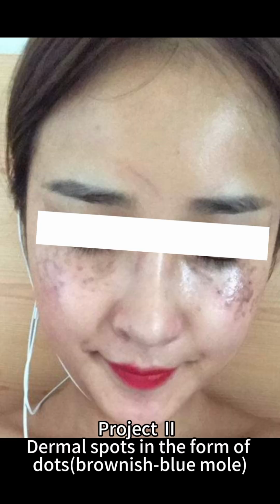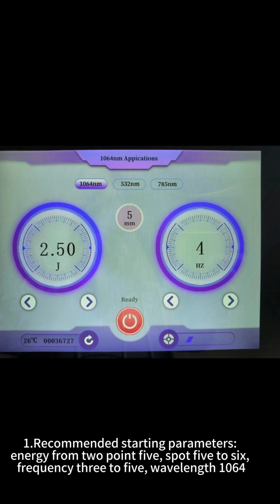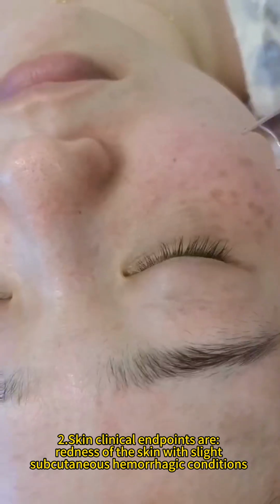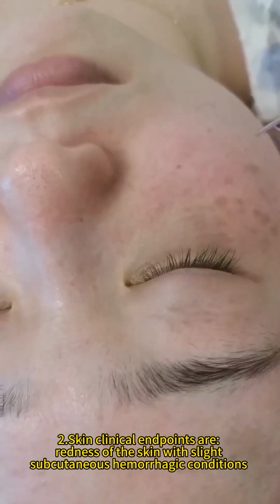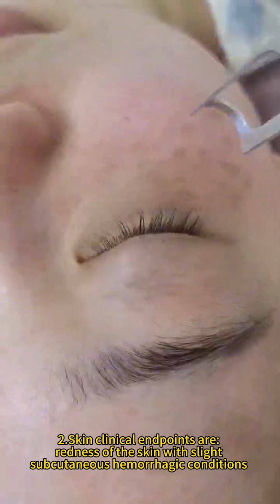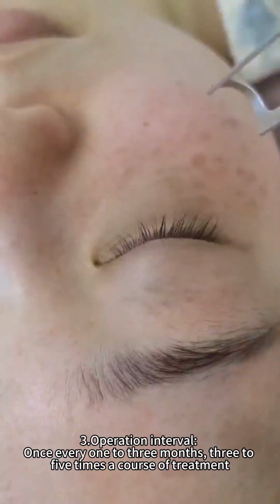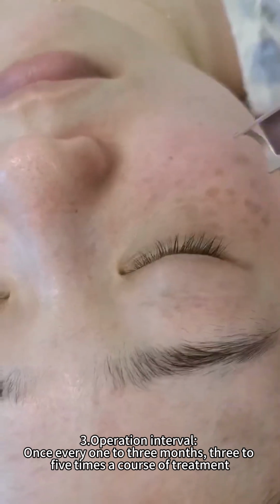Project 2, dermal spots in the form of dots, brownish blue moles. Recommended starting parameters: energy from 2.5, spot 5 to 6, frequency 3 to 5, wavelength 1064. Clinical endpoints of the skin are redness of the skin with slight subcutaneous hemorrhagic conditions. Operation interval, once every 1 to 3 months, 3 to 5 times a course of treatment.